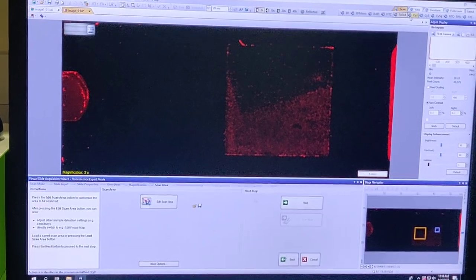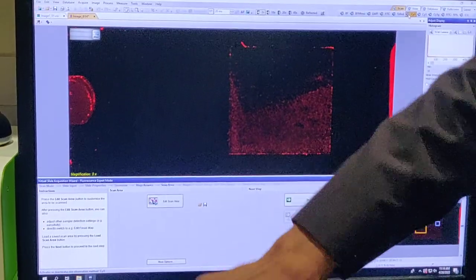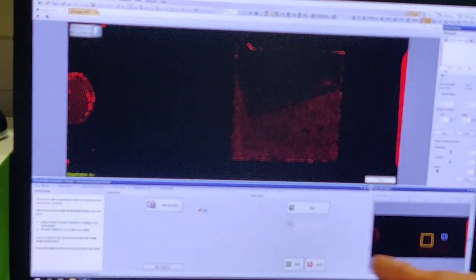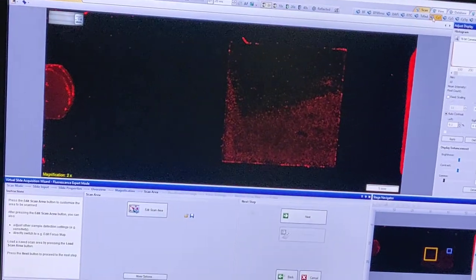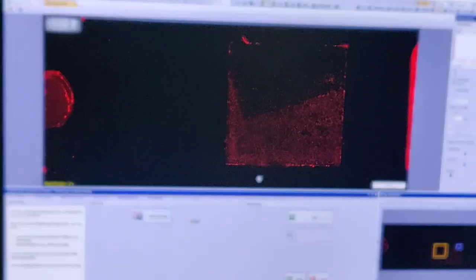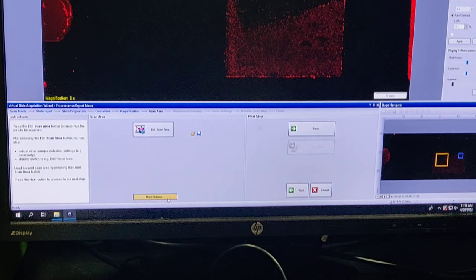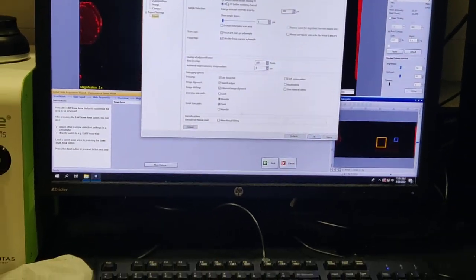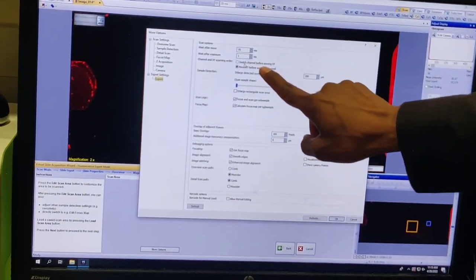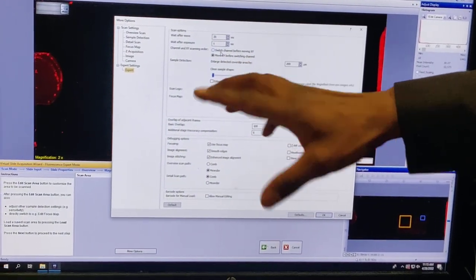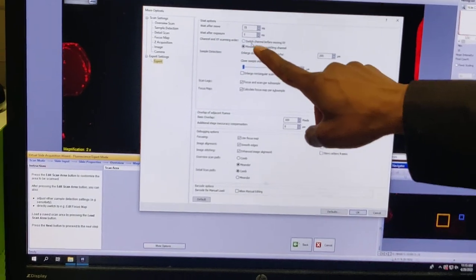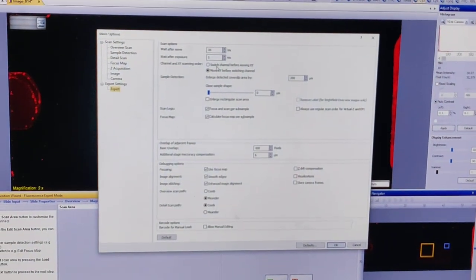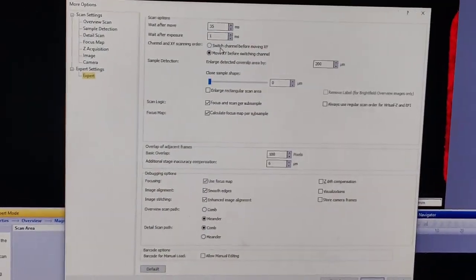If you follow the second protocol, it will keep changing the filter wheel, taking three or four times longer with no real image quality improvement. To access the faster protocol setting, you need to press Shift and then 'More Options' — the expert settings will only appear when Shift is pressed. Under expert settings, you can choose to move XY before switching channels. I always prefer that second option — move XY before switching — unless it's a live sample. The software hides expert settings behind Shift; as I joked, you need to be expert enough to press Shift.